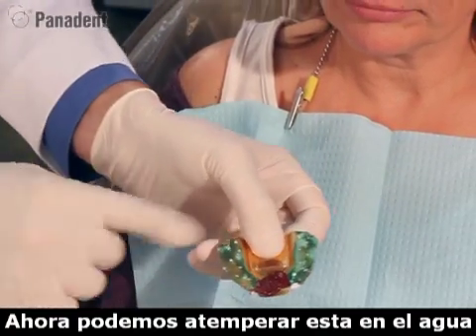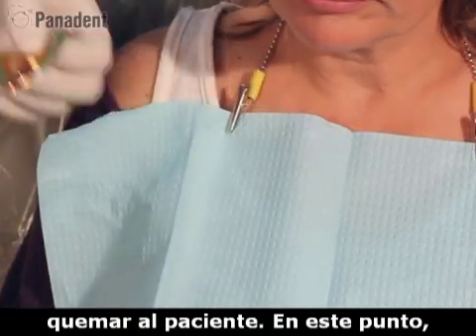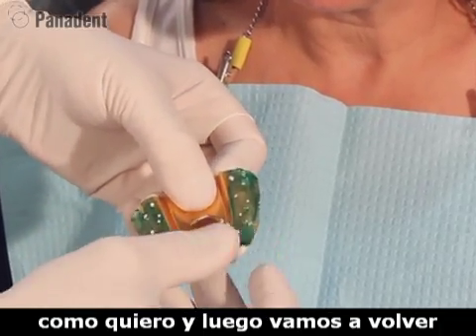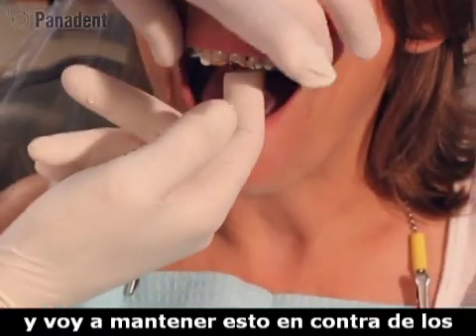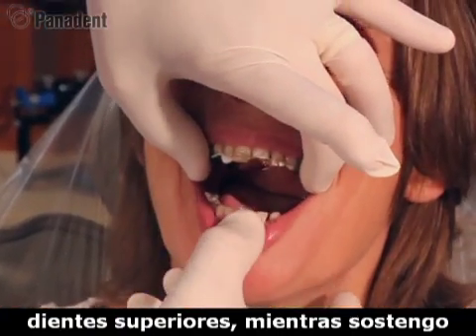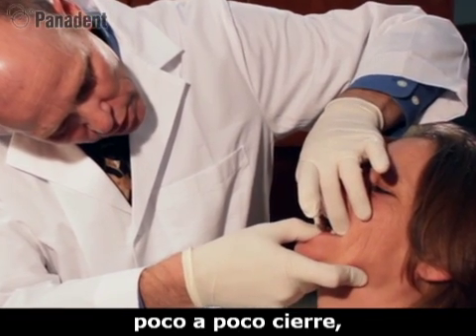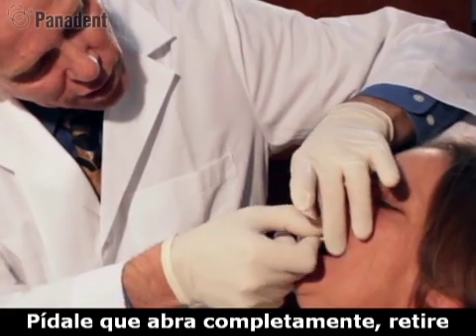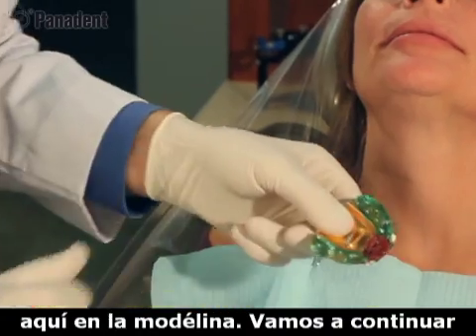Now we can actually temper this in hot tap water because we don't want to burn the patient. At this point, if I want, I can even kind of move it around or form it how I want. And then we're going to come back in the patient's mouth. I'm going to hold this against the upper teeth while I roll the lower lip back, push back on the chin, have them slowly close, slowly close, and open. And we open all the way, remove the tray, and we can see we have an index of the lower teeth here in the compound.